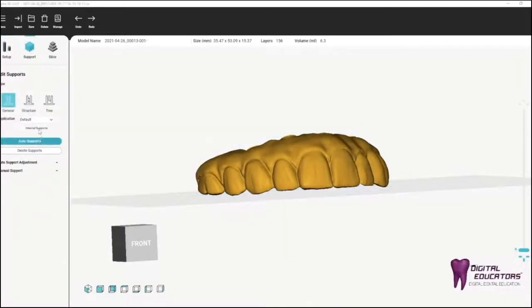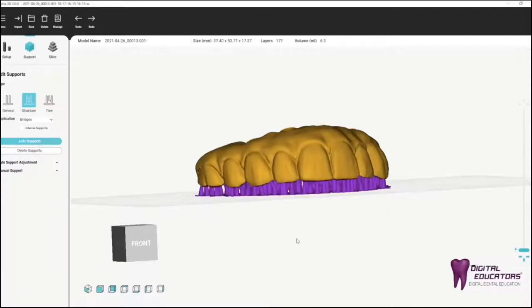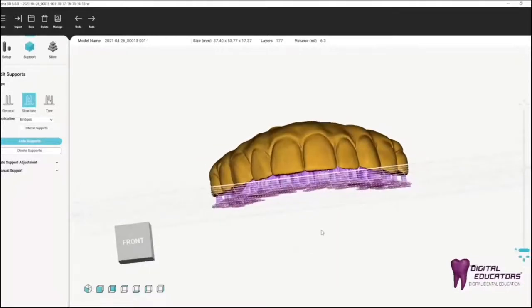And then we'll have to do the supports. One of the great things about Alpha 3D software is that it's so easy to add the supports. Now, there are going to be some manual changes that I'll make, but in essence, there are presets for the different types of dental appliances. You can see here the supports have been added.